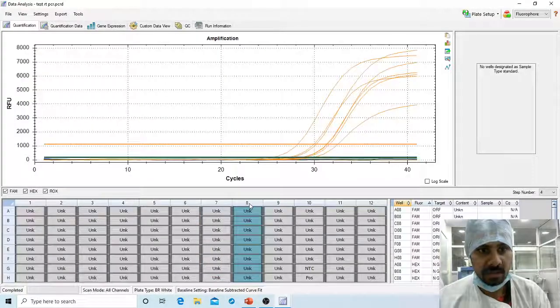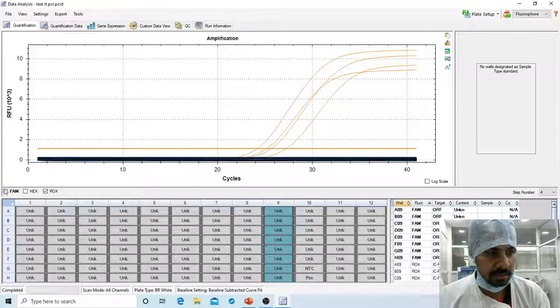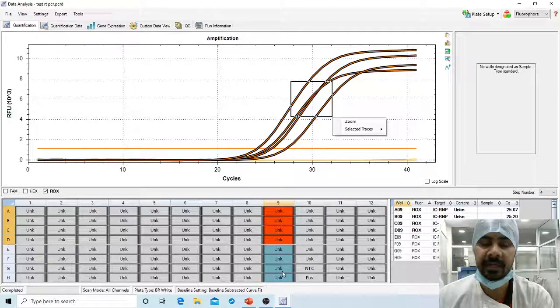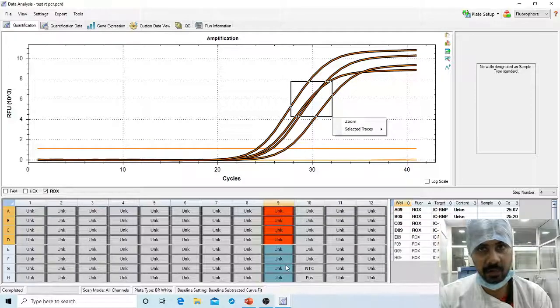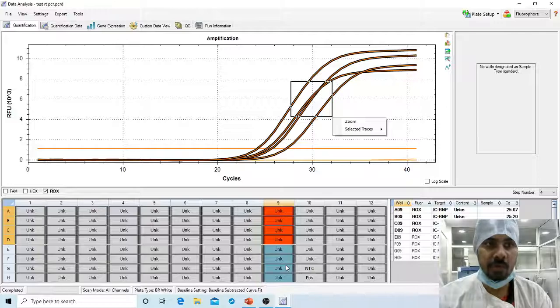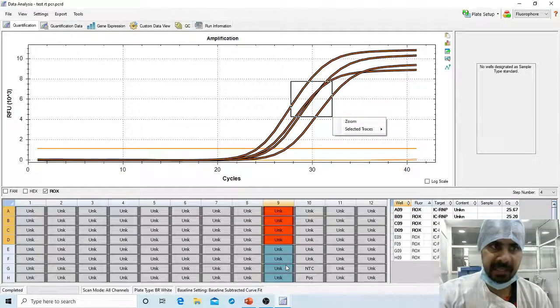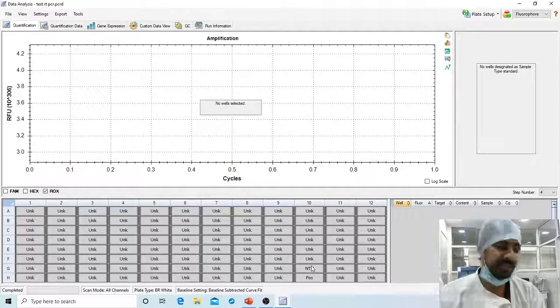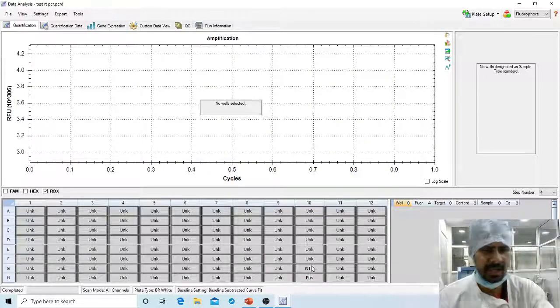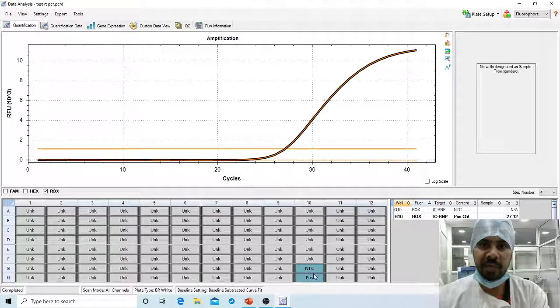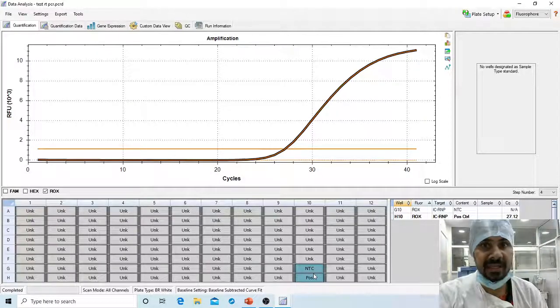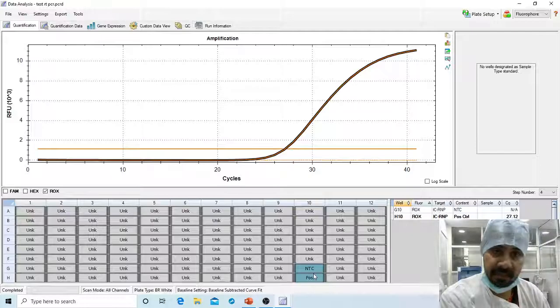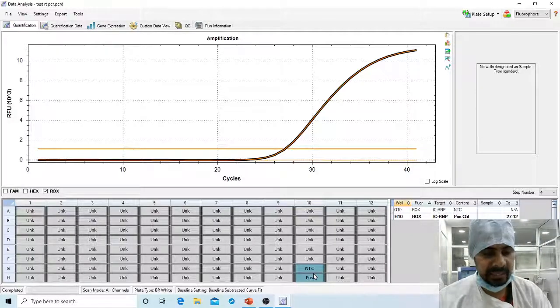You must check each and every well for positive or negative results. In some rows, only four samples can be declared positive or negative; the rest must be declared repeat sampling — no positive or negative result — because there is no RNA or no throat swab sample received in the tube. Quality control parameters are very important: in any PCR experimental setup, if you don't have positive and negative control results, no experiment can be declared conclusive.